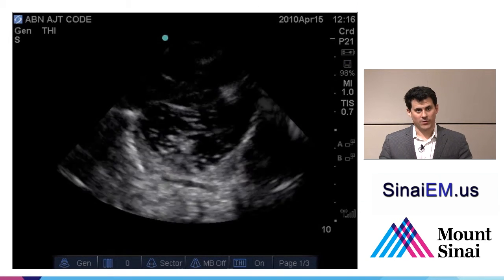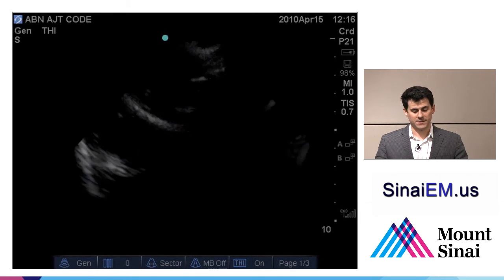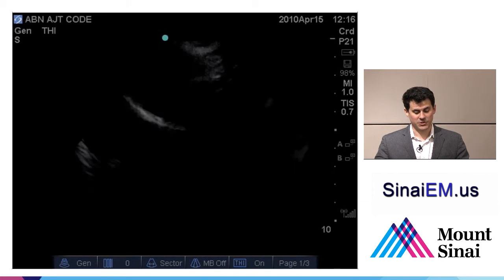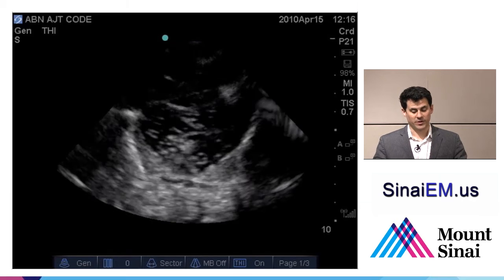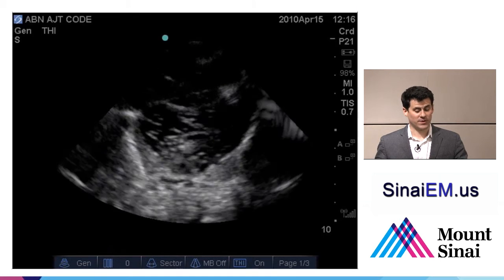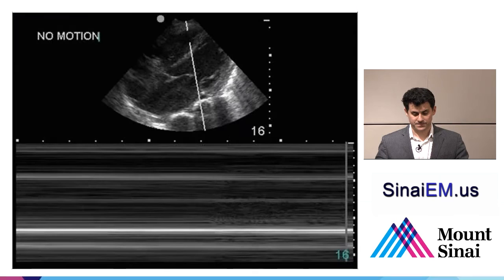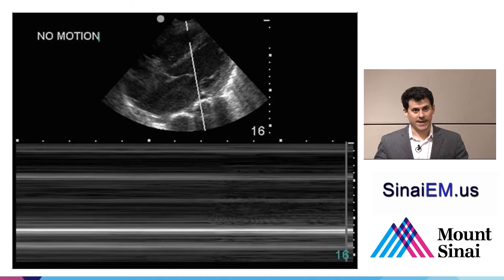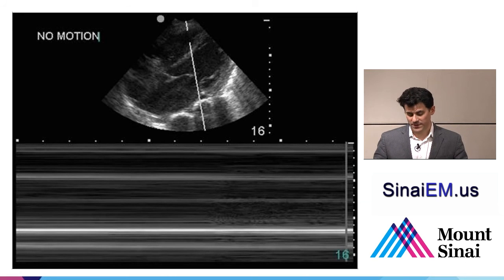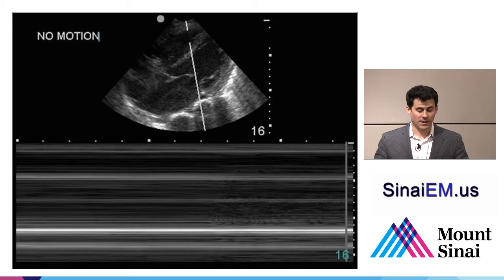One more example where the practitioner had the probe ready in the sub-xiphoid area. When chest compressions stop for the pulse check, you can quickly manipulate the probe to see the heart — just a gentle swirl of fluid, probably left over from chest compressions, and certainly no cardiac activity in this code. M-mode can also be used to demonstrate this: an M-mode line straight through a heart that's not beating will demonstrate flat lines.